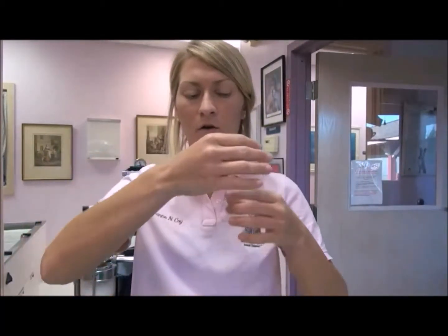Sometimes with a fractious or feral pet, you may need to use an induction chamber. How this works is you would place the patient into the chamber. It's a clear fish tank-like enclosure, but it does have a lid on it, and it'll have a portion where you'll connect the rebreathing tube in. That way you avoid harming yourself or the pet harming themselves during the induction process.